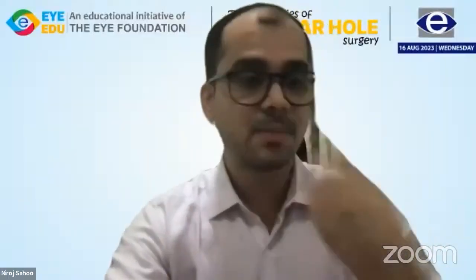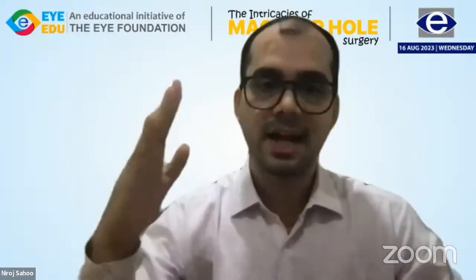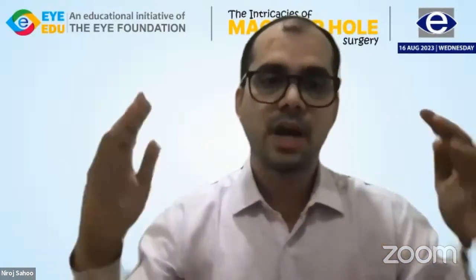If I have to ask you, apart from MLD, if you want to use one indicator constantly in your day-to-day practice, what would that be? I usually use MHI. As I said, the evidence is quite good. And if you look at it from the perspective of a drawbridge, if you consider a drawbridge which has a big base, and if the height is more, it will tend to oppose each other much better than those that have a smaller height. So MHI, both in terms of evidence and in terms of logic, gives us a better idea whether the hole will close postoperatively or not. So I would like to use MHI.